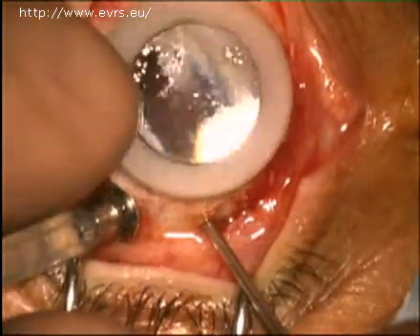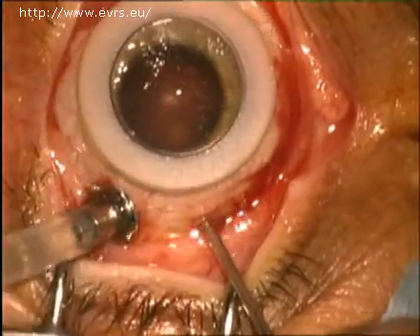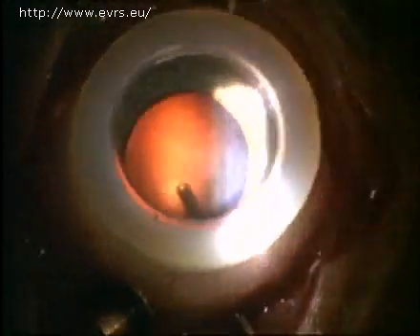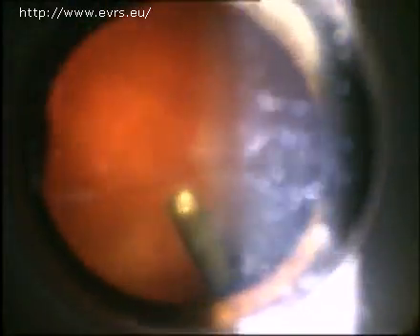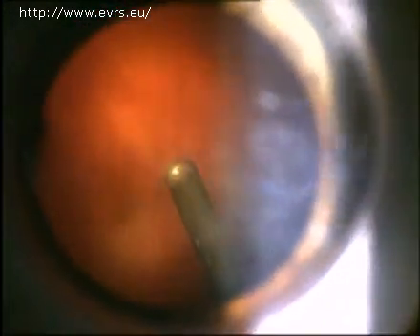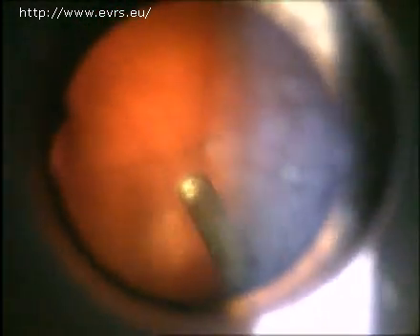Here is an example. In this case, the retina is far away from the center of the eye. Therefore, the central vitrectomy will not pose great risk. One would want to be quick and efficient, and would desire to use an elevated flow around the order of 15 to 20 cc per minute.